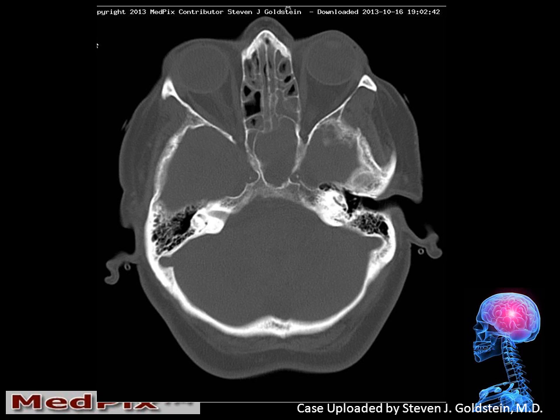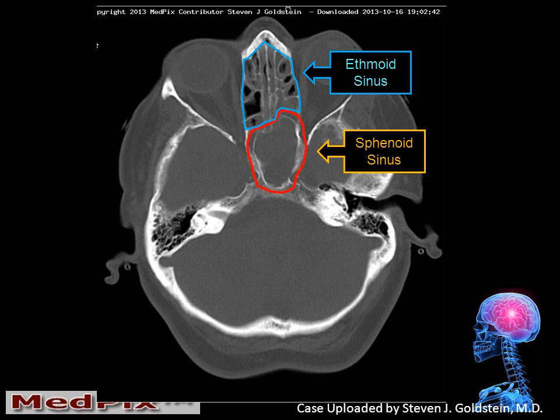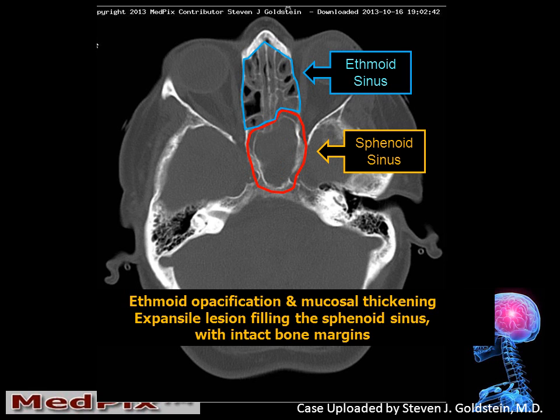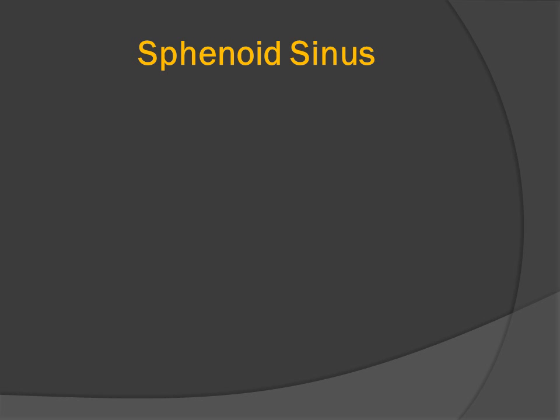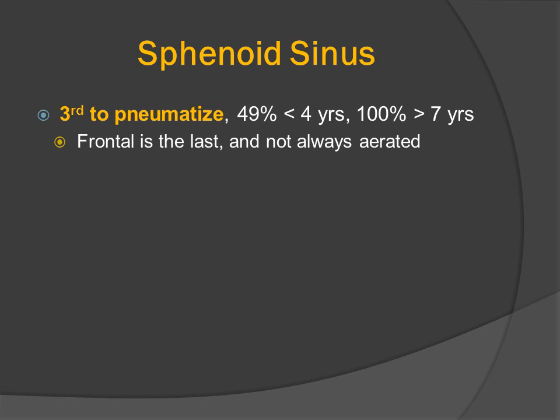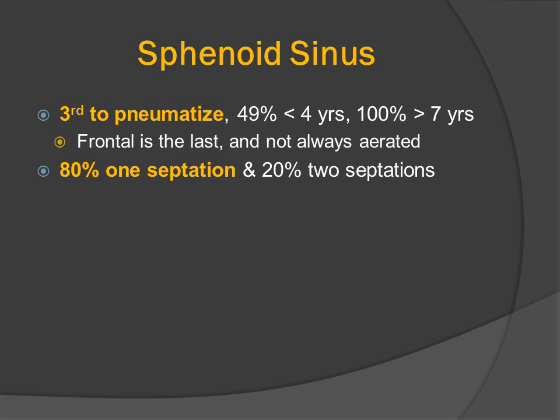The bone window image demonstrates the sphenoid sinus with mucosal thickening and homogeneous opacification of the sphenoid sinus with slightly convex margins. We have evidence of recurrent or chronic sinusitis as well as a fluid-filled sinus. The sphenoid sinus is the third to pneumatize. The frontal is usually the last and does not always become aerated.